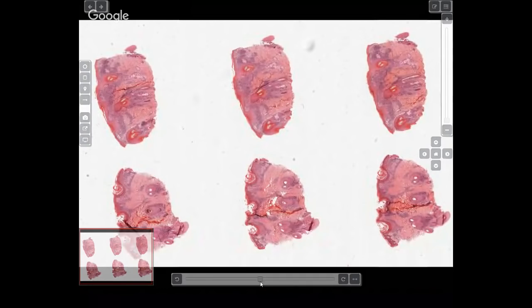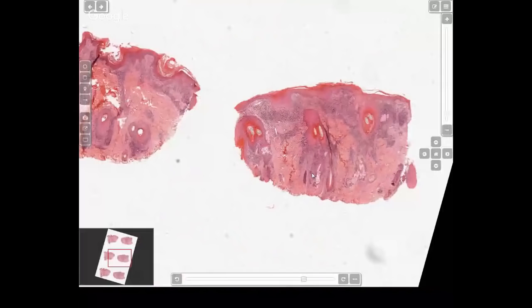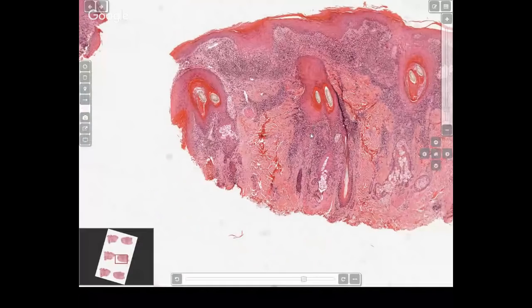Histologically, we already saw one case, and again you see the lichenoid infiltrate. But like I said, whenever you see a lot of perifollicular and perivascular involvement, you're going to think of connective tissue disease. So if you see a lichenoid infiltrate, you see the hypergranulosis and everything, but now this is involving the hair follicle and also the deeper part of the dermis, then you're going to think of a connective tissue disease. Then you do your mucin stain, and you're going to find that the mucin is positive in the dermis. You can also look up the clinical history, whether the clinician has done some serology. The ANA is going to be positive, and if immunofluorescence is done, you're going to see a full house at the dermal epidermal junction.